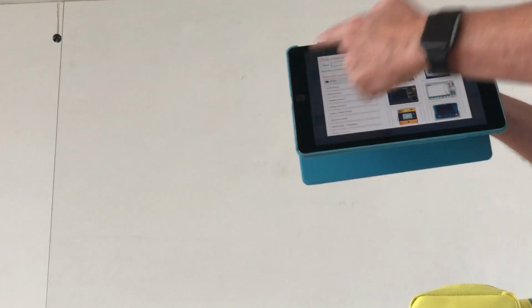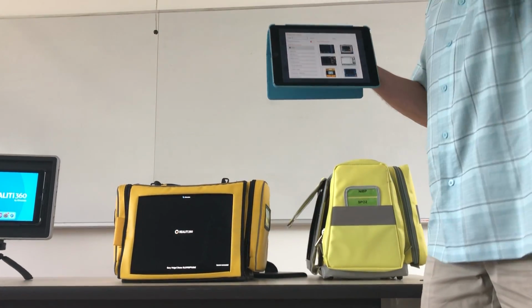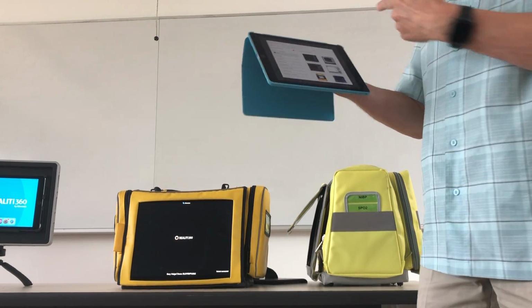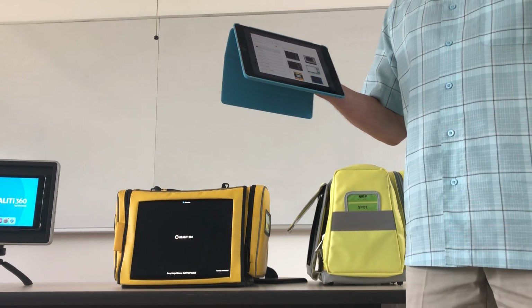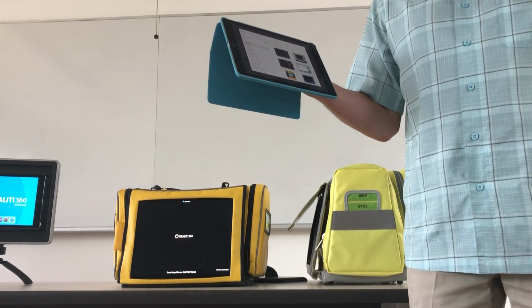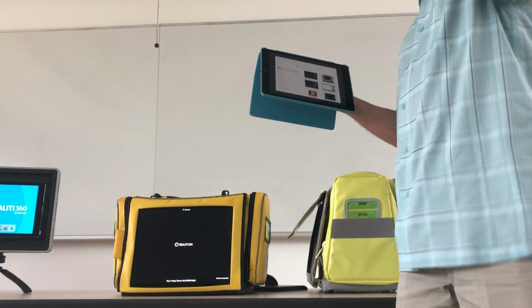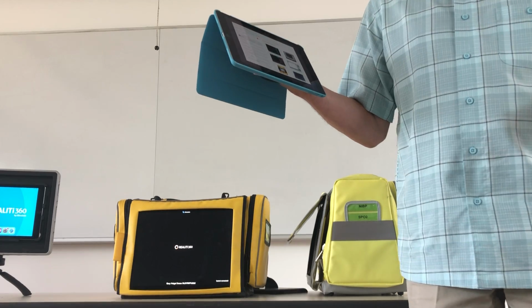Next thing I do, it's got this screen, and this is where I have scenarios. You can have folders within folders of scenarios in here that are pre-programmed if you want, or you can just start it on the fly. I would suggest that you create scenarios to start from, because if you try to just pick a monitor, start entering things, and then you stop it and go to start it again, sometimes you lose those settings.